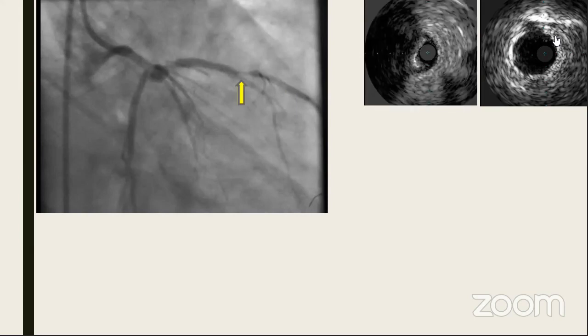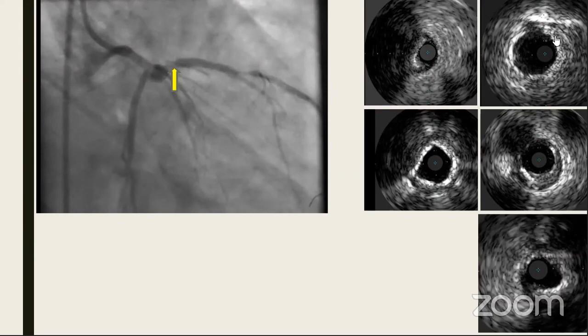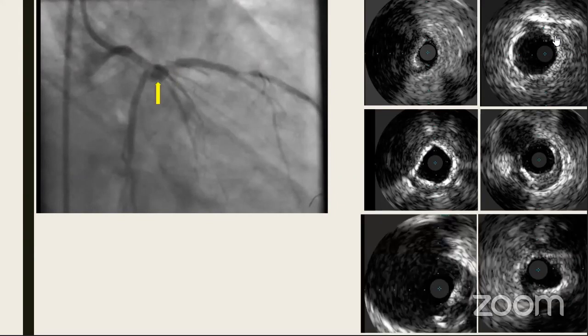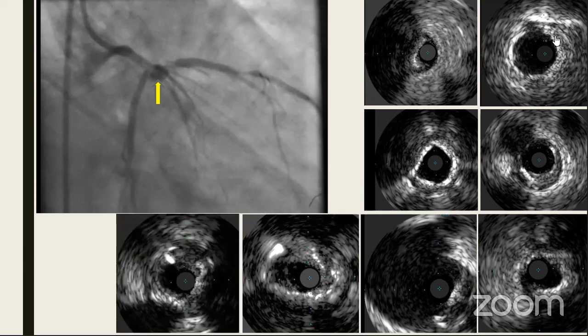This was the tight lesion in the mid LAD that was immediately distal to the diagonal branch. This was the origin of the diagonal, obviously. The fourth image was the long calcific lesion in the proximal LAD. This was the site of the aneurysm that we are now sure is related to the LAD proximally. And this is the entrance of the circumflex wire. Again, entrance of the circumflex wire into the left main.